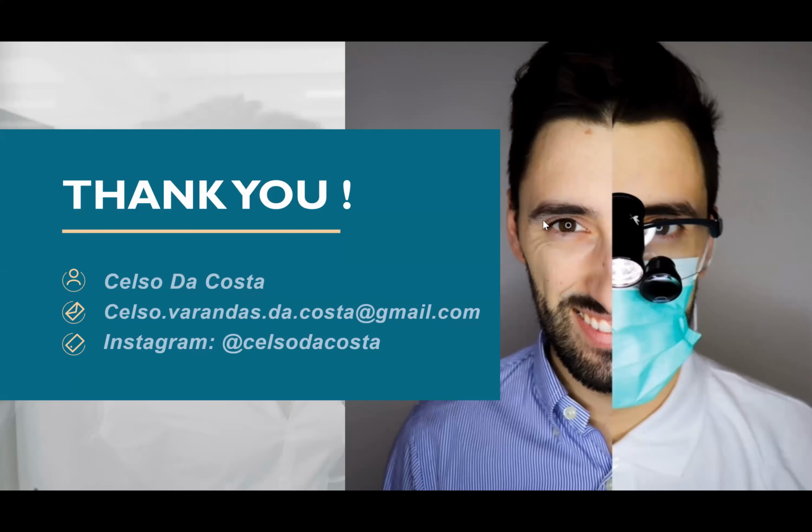Hi, Anna. Yeah, normally I propose the home kit for people with enamel that is harder to bleach. That's why I'm using the home kit. If I can use it the week before or after the CLICK, I have done it. It works, but for the harder cases like C and D shades, I always do CLICK plus the home version, because you're going to stay longer in contact with the teeth of the patient. So you're going to get more durable and better results.